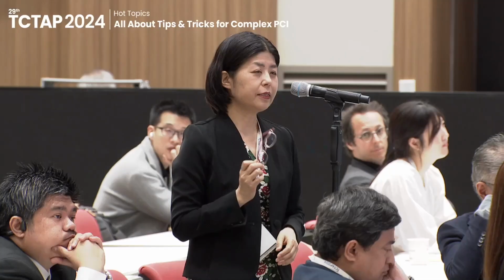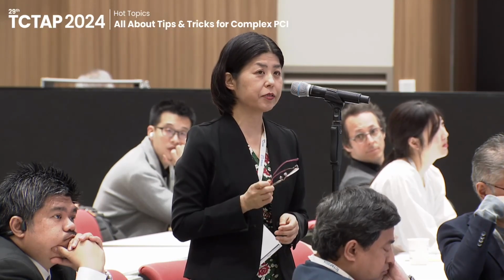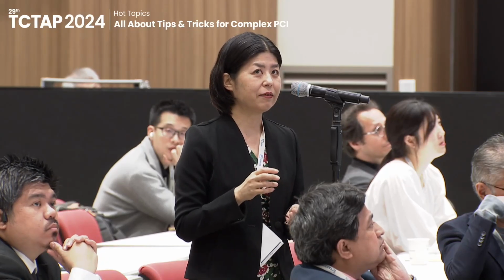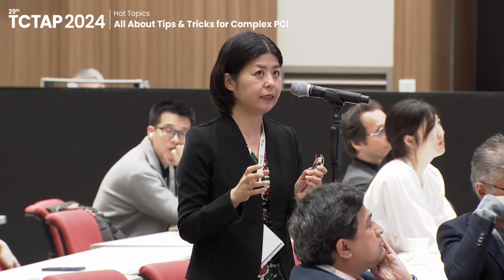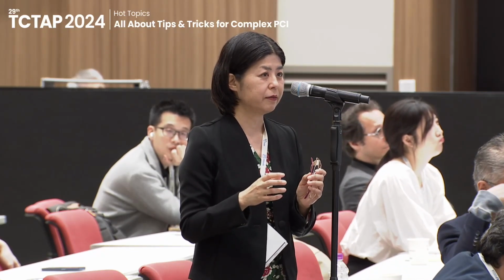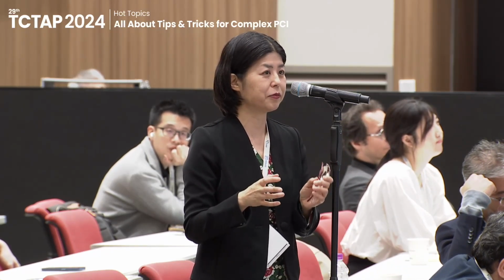I mean, is medical therapy more important for the eruptive calcified nodule than the technique for intervention, and for the non-eruptive calcified nodule, is the technique more important than medical therapy? I think in terms of the medical therapy or best treatment, we don't know well. But I think for both types, the acute goal is really good stent expansion, no matter how the calcified nodule looks.